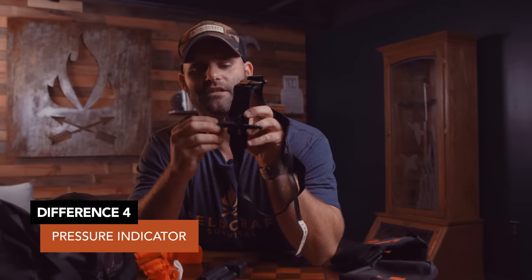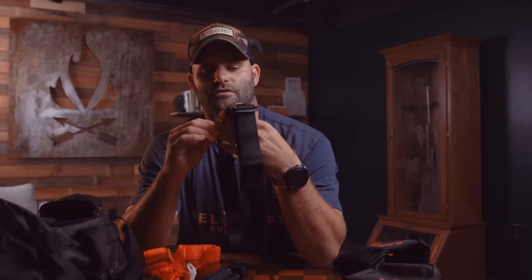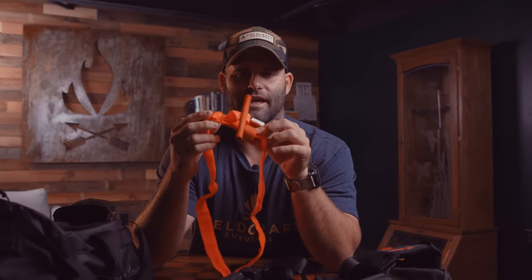The other thing the CAT doesn't have is a pressure indicator. One of the big features on the SOFTT-W is this red triangle, which tells me when I have adequate tension for that initial bite. If that's not tight, you're going to spin the windlass and spin and spin because you didn't have the initial pressure on the limb that you needed. Having that quick indicator to let me know I'm tight before I start spinning the windlass is kind of a big deal. It's one of the most common reasons I see people not achieve hemostasis with the CAT — they don't have adequate initial bite due to positioning or not wanting to apply enough pressure.